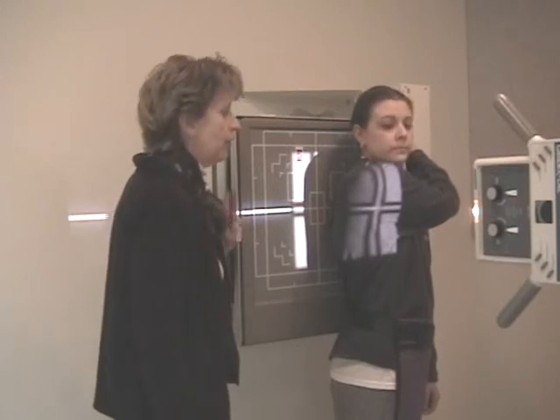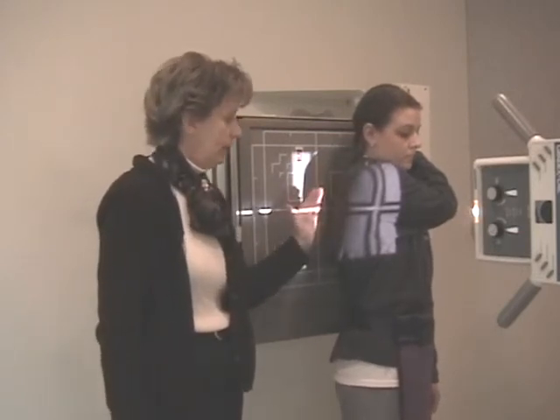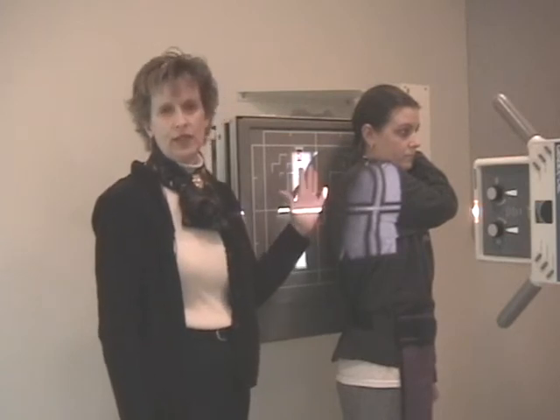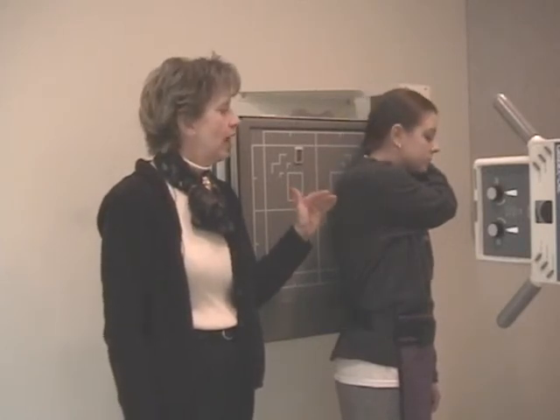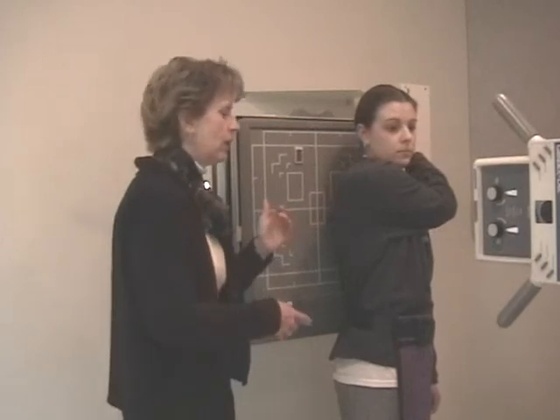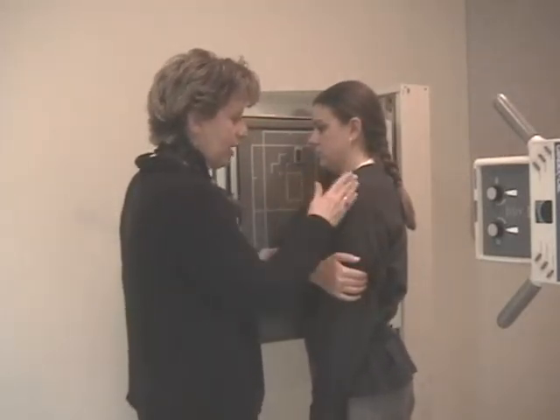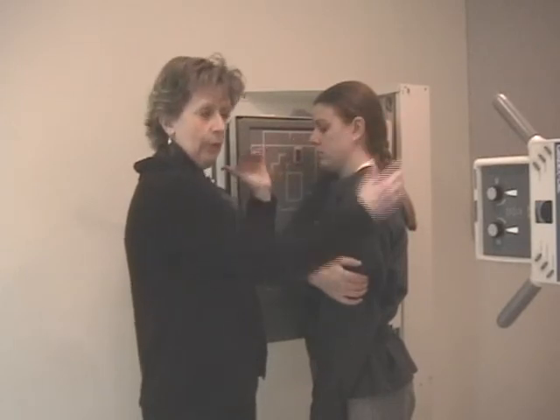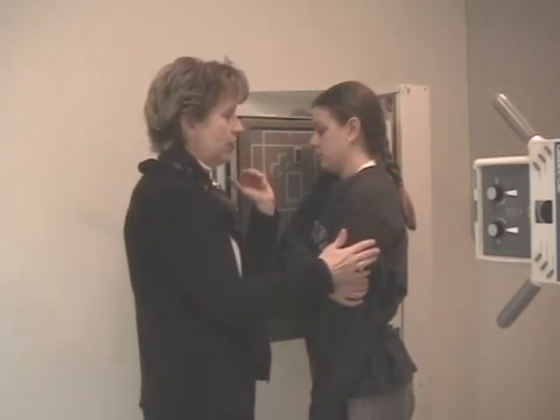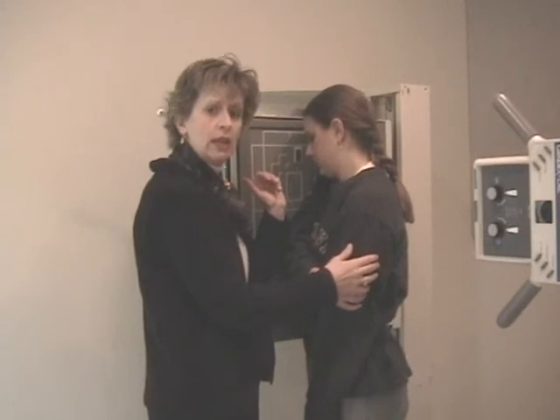Have the patient hold their breath, then rotor and expose. If you choose to do this AP, remember the negative is that you have OID. To address OID, increase SID and use the density maintenance formula to adjust your exposure settings. If you do it PA with the patient reversed — the affected arm coming across the chest, body positioned steeply rather than shallow — you superimpose the two borders just like with the scapular Y. The scapula comes right down the center. The advantage is there's no OID.